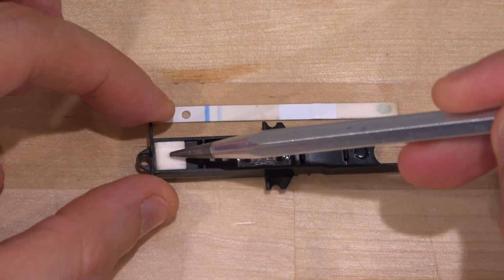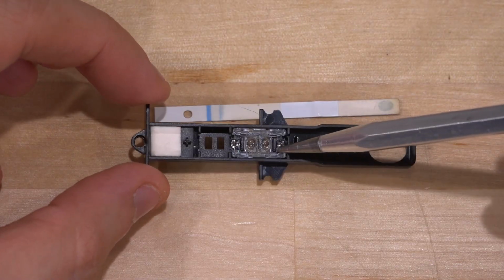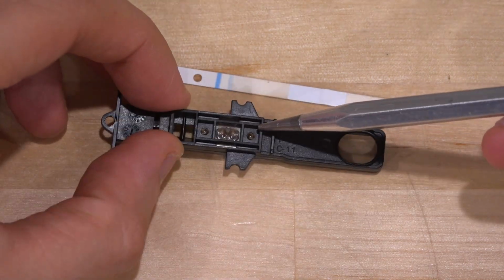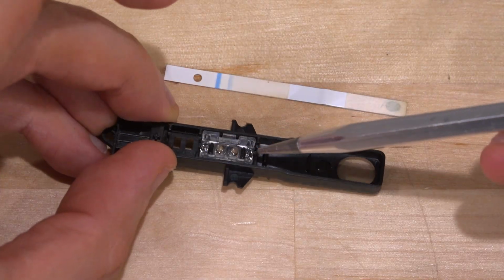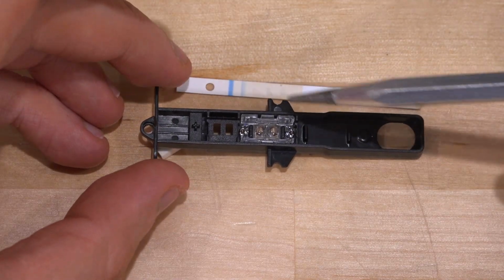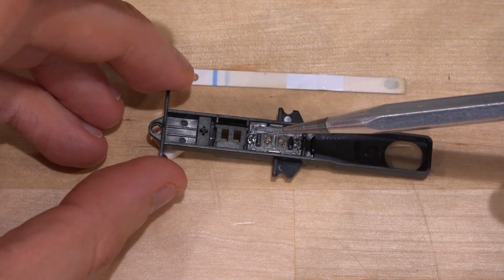At the end, there's a sponge in here, which I assume just wicks away any excess fluid so it doesn't get on the electronics. Interesting. So these lenses are actually directional, so they're pointing away in a certain way. Oops, I think this is just so that when you put light in here, it shines in a certain direction. Interesting. I think this might be just to make sure that the dye is moving in this direction. Maybe that's what it's monitoring. That's a lot of hardware. Interesting. But of course, because you're not looking at it, you really need to be sure that it is done correctly.